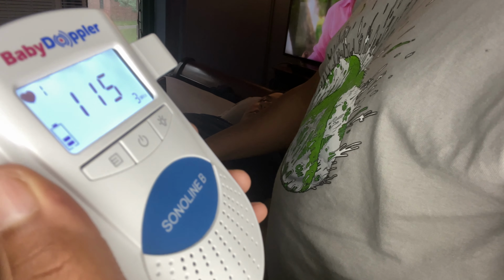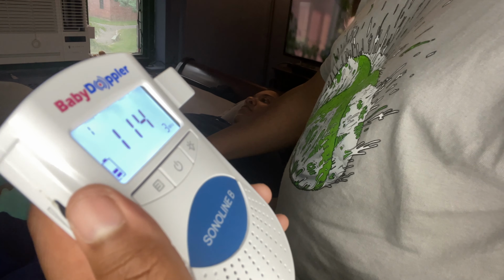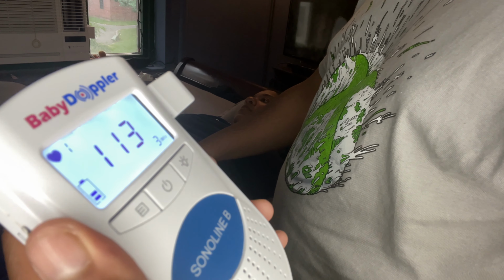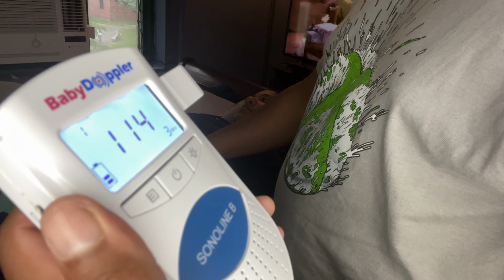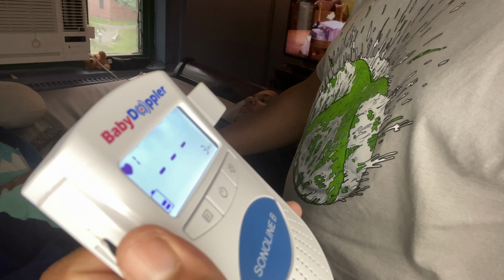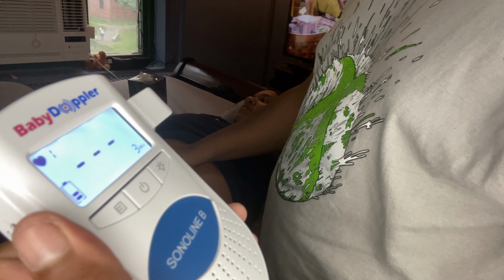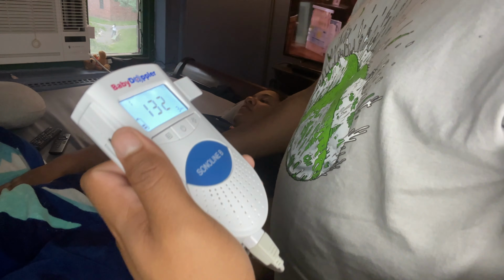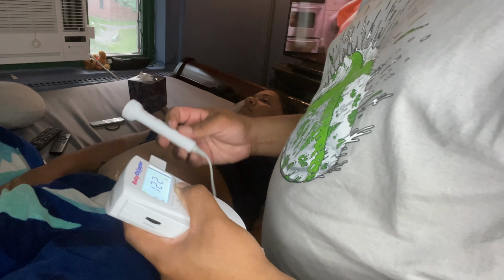Don't take the numbers at face value. These Dopplers don't give you the most accurate heart rate. So if you see the numbers go up all the way to like 150, and then the next second you see 112, most likely it's fine. Just speak to your doctor. I think we're good.